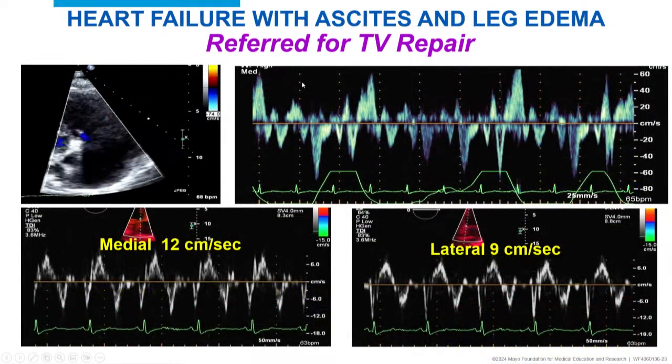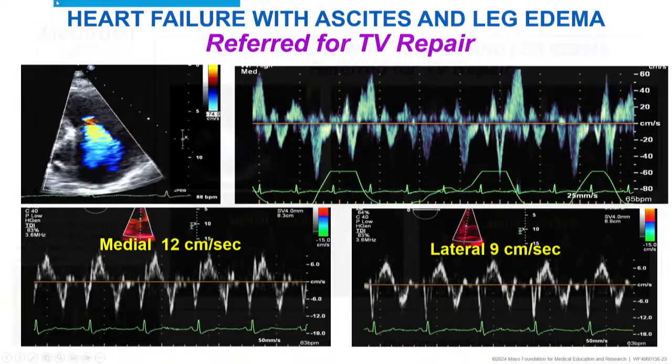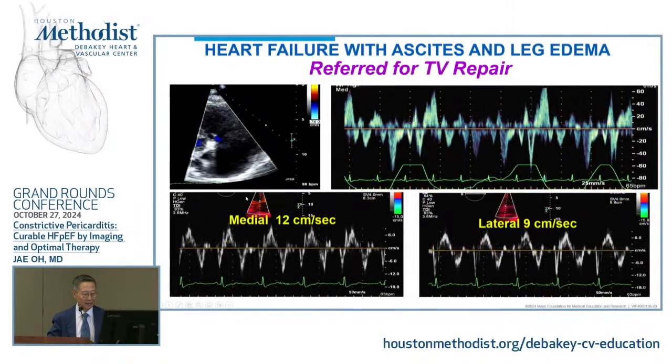I am at the valve clinic, seeing this gentleman that came to us with tricuspid valve repair. We got right heart failure, severe TR. But I always look at hepatic veins. It's just part of the echo. And something unusual here, right? Because you have huge reversals here. I was looking for systolic flow reversals with a severe TR, but this gentleman has expiratory diastolic flow reversals. And you don't really see that in many people.